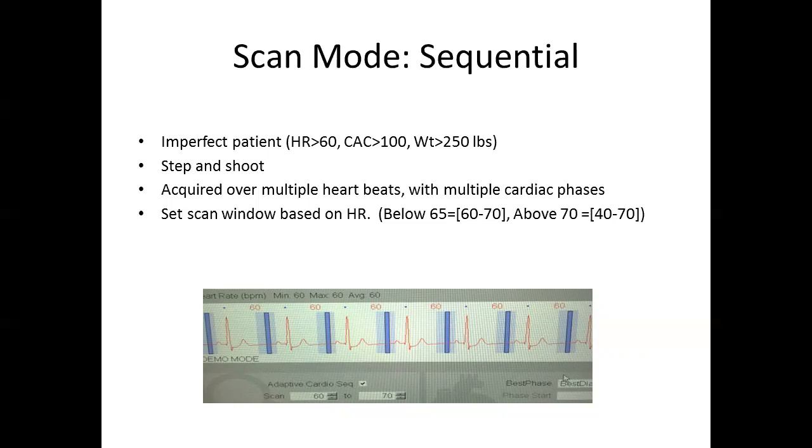So you're just trying to give yourself some leeway for post-processing, and if you had cardiac motion at 60% of the RR interval, well, you have 65%. And usually you can visualize, proximal LAD was moving at 60%, but at 65%, proximal LAD was okay. So you can stitch different parts and see the whole coronary tree that way.